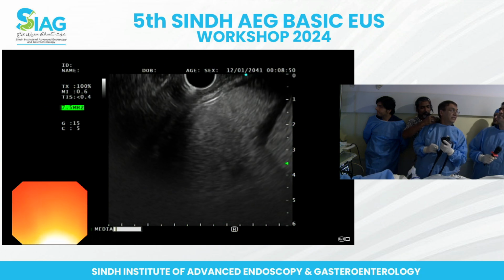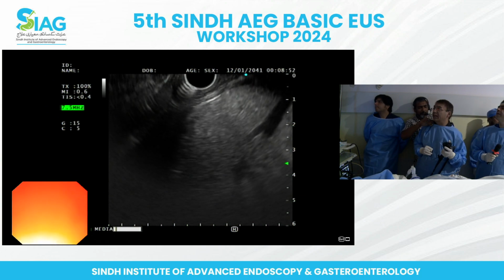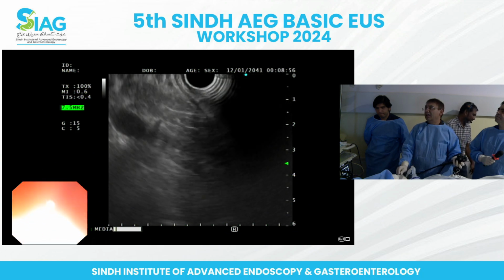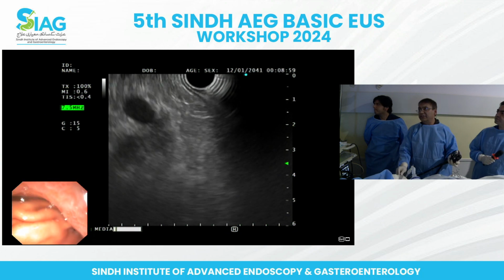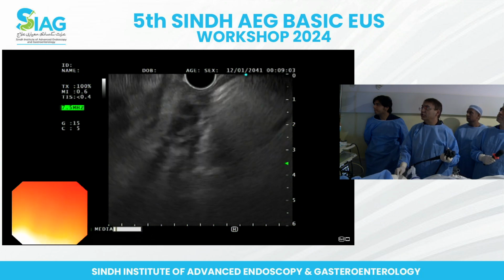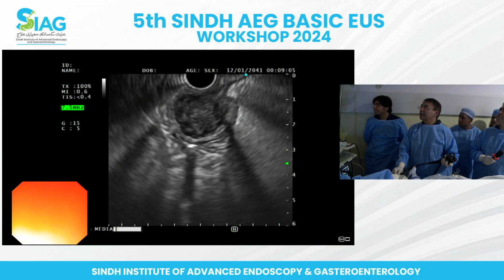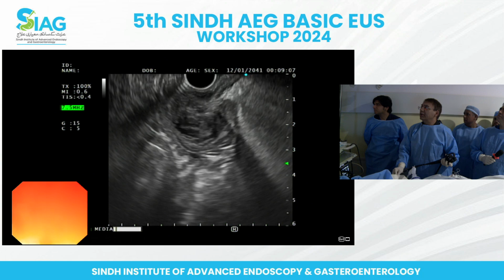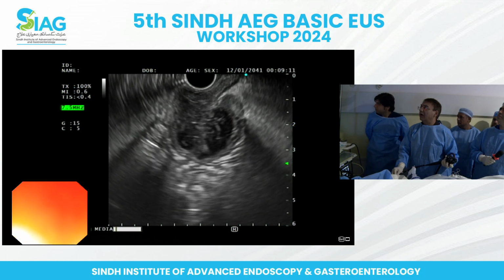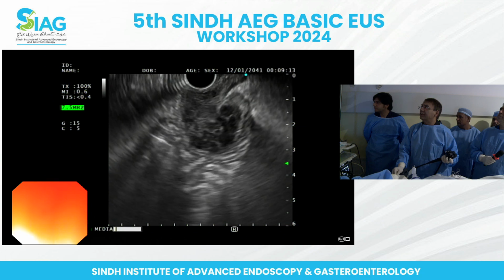So there are some cells. You see those spindle cells in there? Possibly it still could be either of those. I think this is just going to require a staining of the tissue to determine that. Here, I'm going to try to show you where the muscularis propria enters in there.